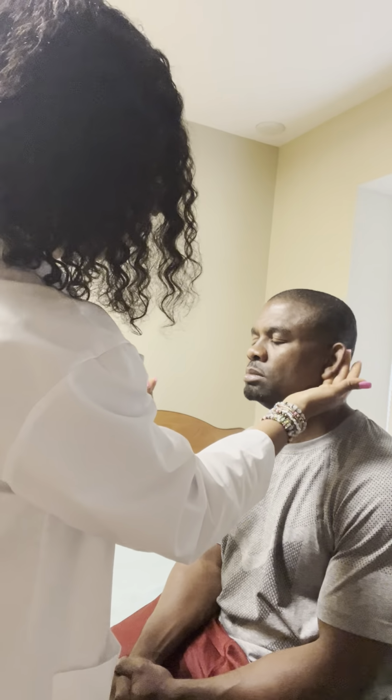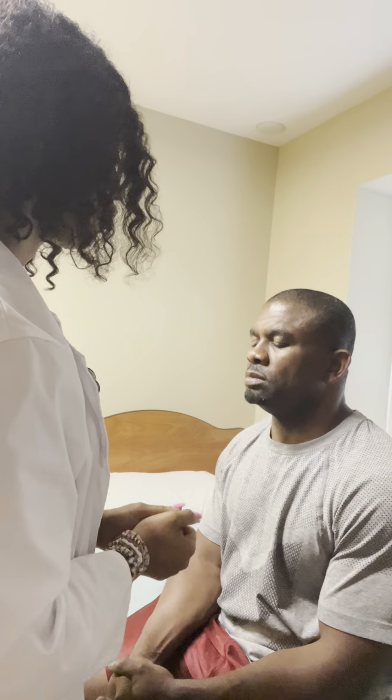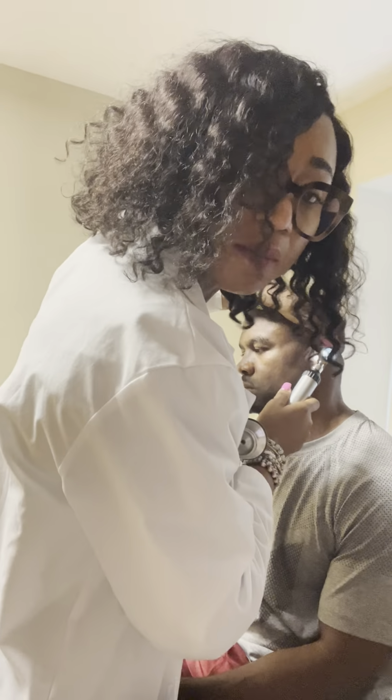Next, I'll be checking the ear. I will inspect the ear for any nodule or redness. Do you have any tenderness? Yeah. I'll be using my otoscope to look inside the ear, and I will pull the ear up and back, and I'll be assessing the external auditory canal for any redness. I don't see redness, swelling, drainage, or discharge. The tympanic membrane is pearly gray, and the middle ear has no effusion.